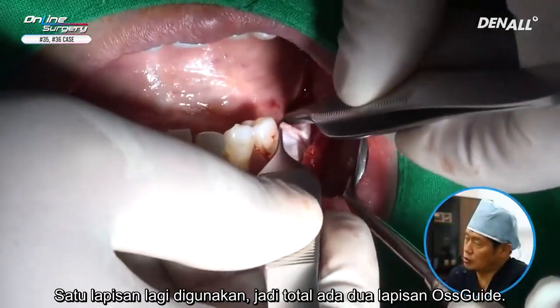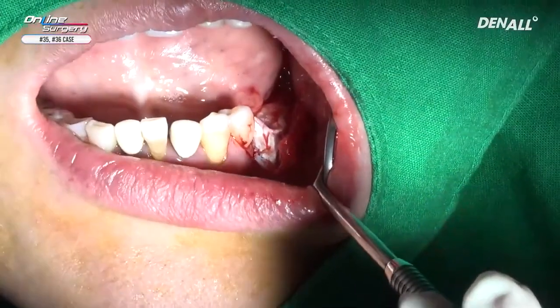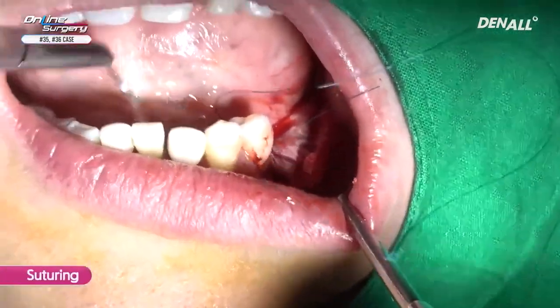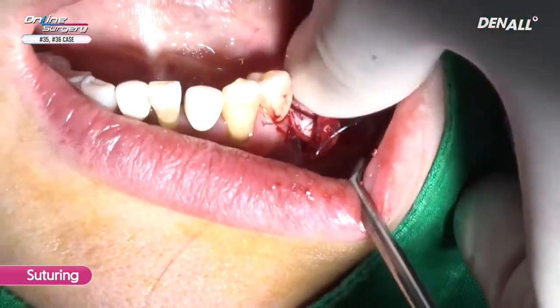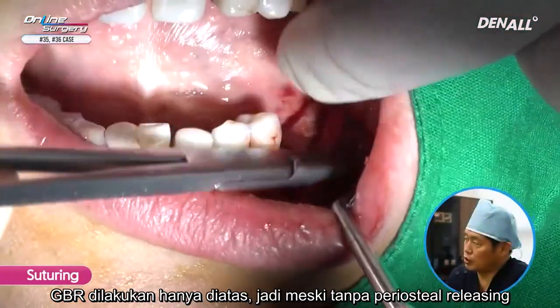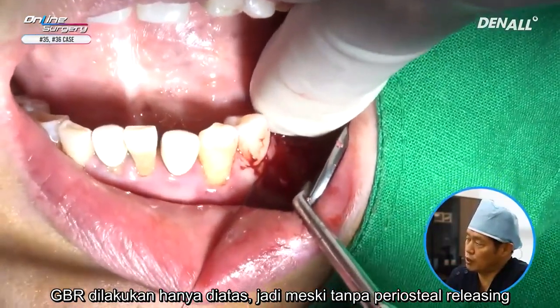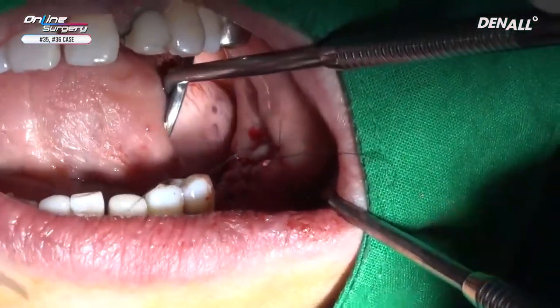One more layer was used, so a total of 2 layers was used. GBR was done only on top, so even without a periosteal releasing incision, the flap can be closed nicely.